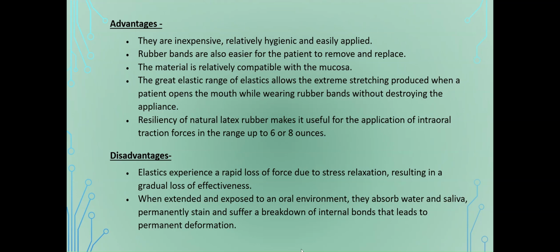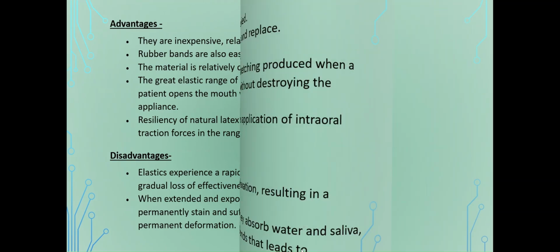Disadvantages: elastics experience a rapid loss of force due to stress relaxation, resulting in gradual loss of effectiveness. When extended and exposed to an oral environment, they absorb water and saliva and cause permanent stain and suffer a breakdown of internal bonds that leads to permanent deformation.